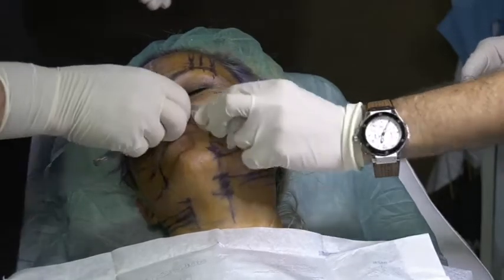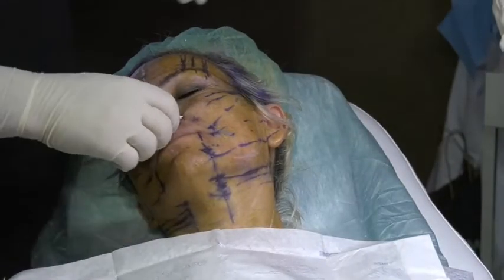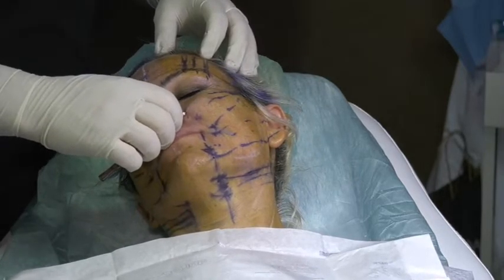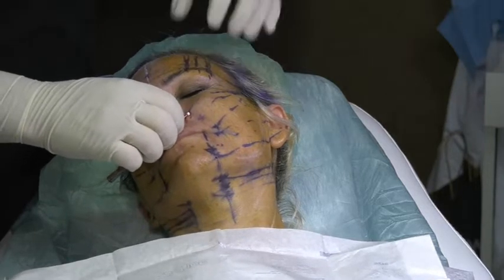Done. That means now I am in subcutaneous level. You can move the cannula up and down. When you move the cannula free up and down, that means in subcutaneous level. Now I will start stage number 2. Stage number 2 is drive with soft support.